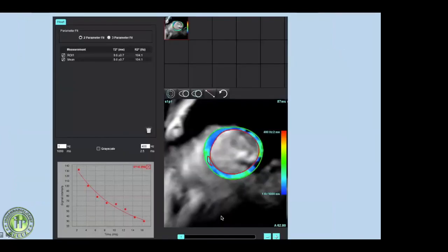On T1 pre- and post-contrast images, the interventricular septum area did not take up gadolinium, which was suspicious for intramyocardial hemorrhage. T2-star gradient echo images were taken at basal, mid, and apical segments. Placing an ROI in the involved area showed T2-star values below 20 milliseconds — just 9 milliseconds — confirming intramyocardial hemorrhage post-reperfusion. This is a poor prognostic sign; the clinician should be aware, and this patient requires closer follow-up and more aggressive medical treatment.